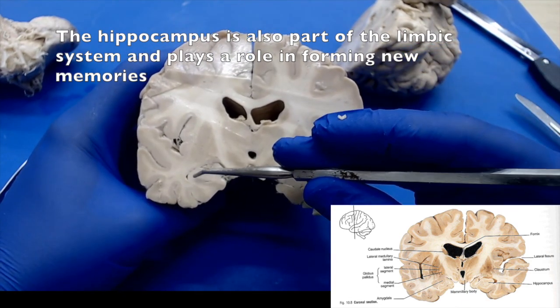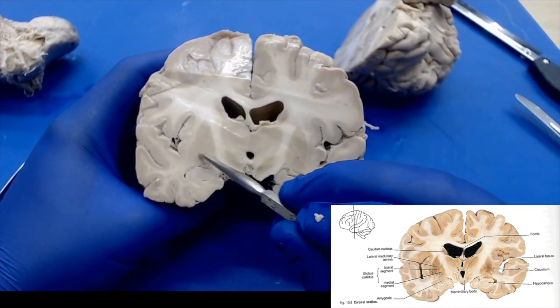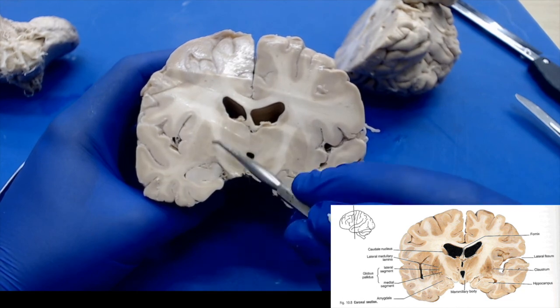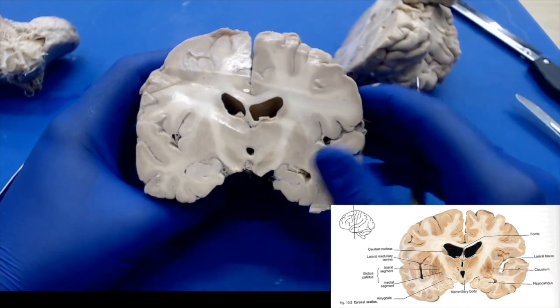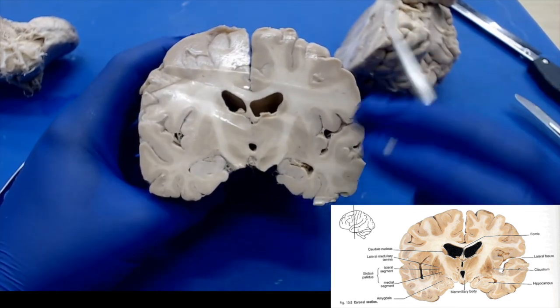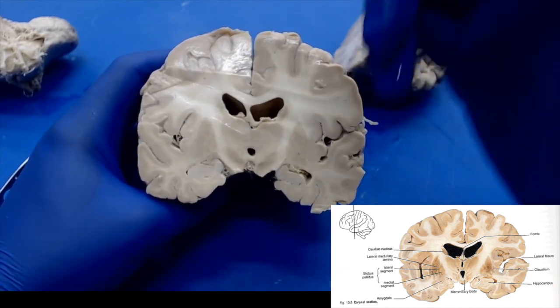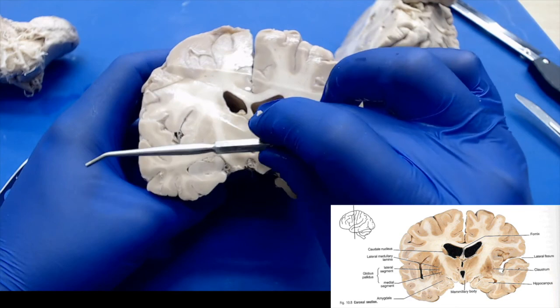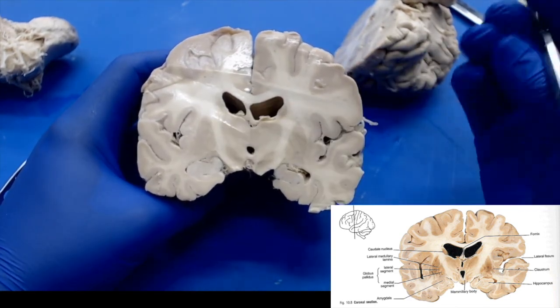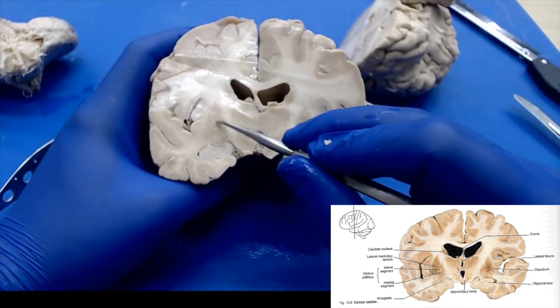So typically what we'll do is we'll get a section of the hippocampus. We're going to get a section of the basal ganglia. Now you can get any one of these nuclei here, either putamen, globus pallidus. Those are usually your good sections. And the reason for that is you can see a lot of motor dysfunctions. So the basal ganglia are really important for fine motor control. So for me to be able to pick up and tactfully move a scalpel, it's because I'm having a really functional basal ganglia. But some diseases can affect that, and in long-standing hypertension, we'll actually see things called lacunar infarcts.